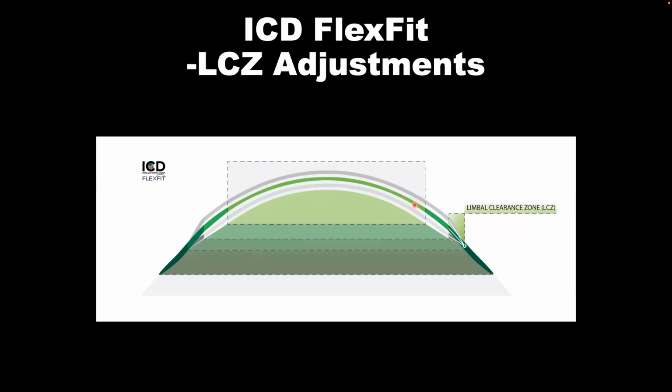So what you can do here is just neutralize this change in limbal with the peripheral. So you can just go, sorry, +5 here and drop down -5 here. And that will maintain the relationship, and that will maintain the 300 microns that you have here. So you can either play with the zones and just go up or down to maintain the central clearance if you are okay with that.